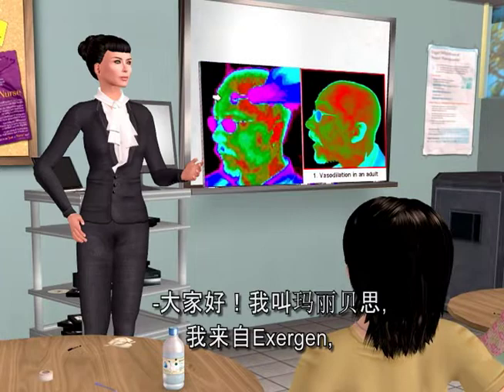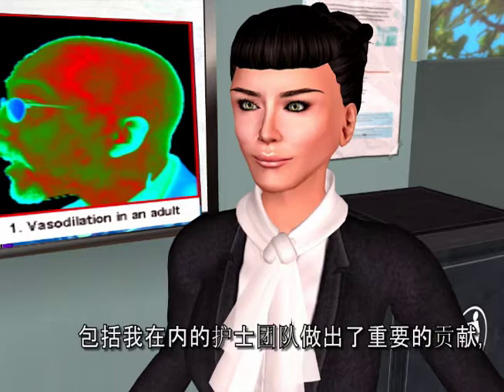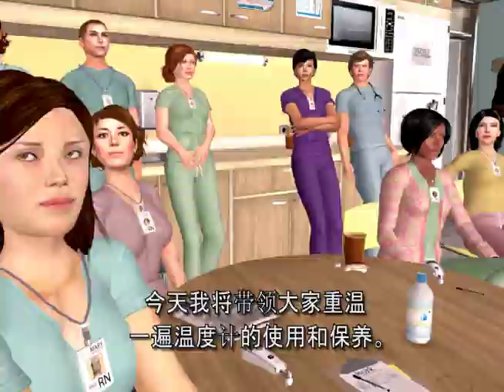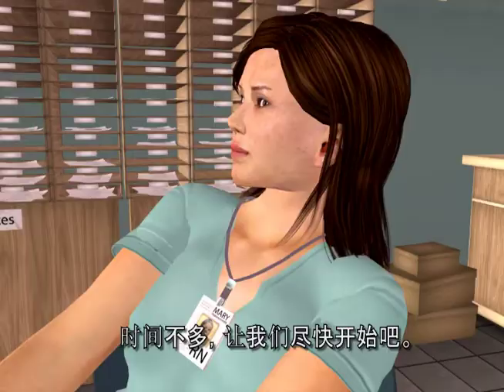Hello, my name is Marybeth, and I'm from Exergen, the company that invented and makes the temporal artery thermometer, right here in the USA. You'll be happy to know that the development of this thermometer included significant input from a team of nurses, including me. I'll be going over the thermometer's use and care today. Come on, let's get started.